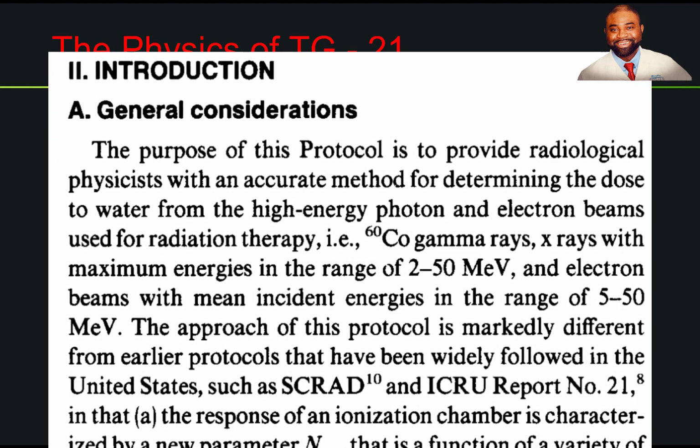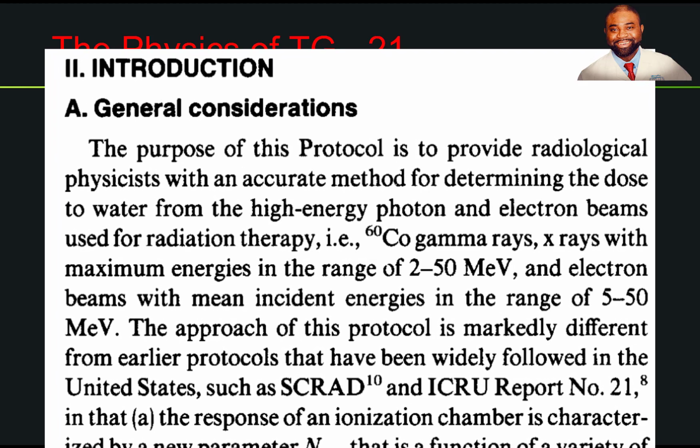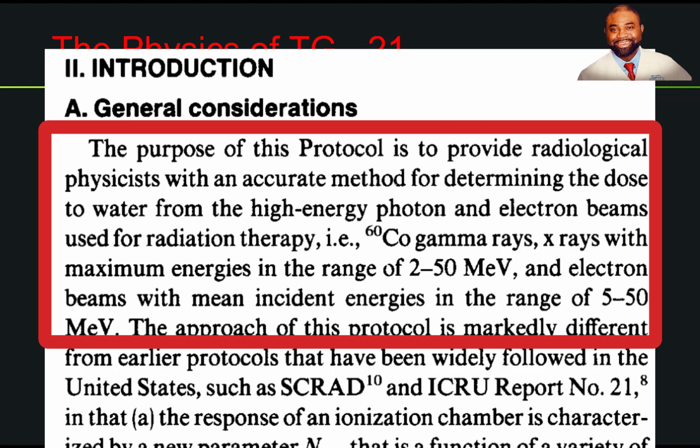It provides an essential framework for the determination of the essential parameters or factors in determining the absorbed dose to water.